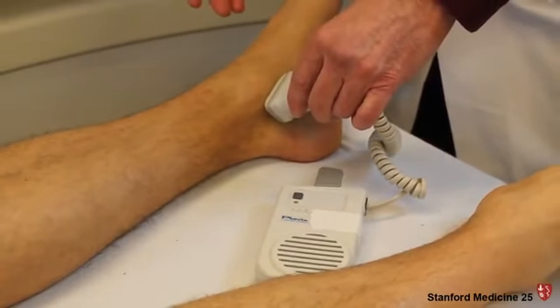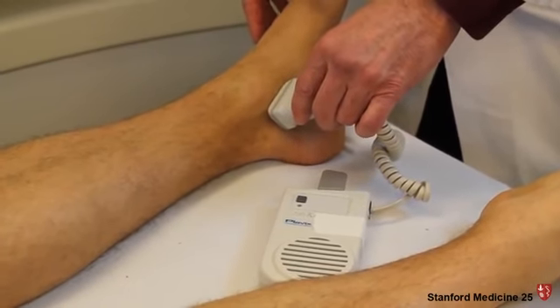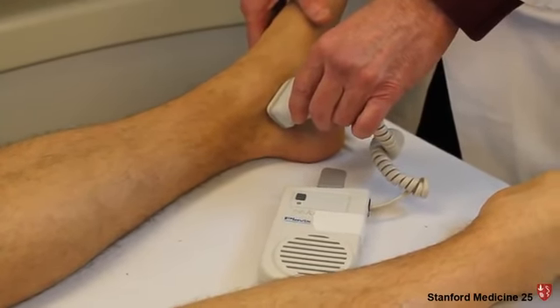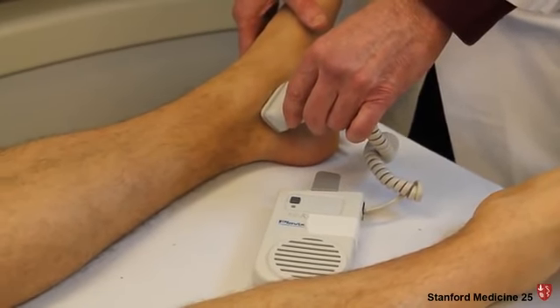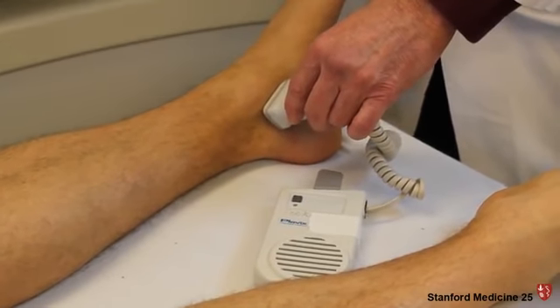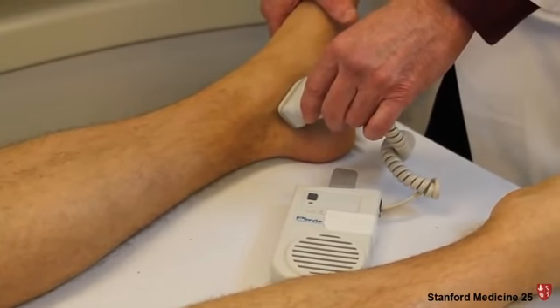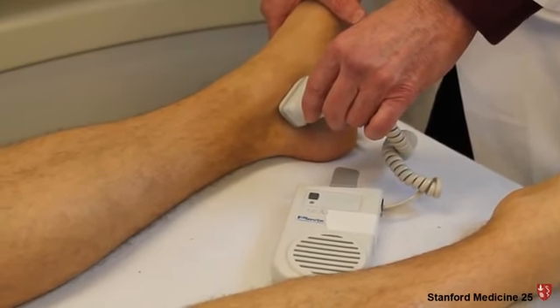And in the foot, you basically listen over the posterior tibial, in this case, and the vein, of course, the posterior tibial vein is running adjacent to the posterior tibial artery. And you can hear the posterior tibial artery signal. You can't hear the venous signal unless you do an intervention. And the intervention is compression to increase venous return. So take a listen now to the arterial signal and watch what happens when I compress the foot.